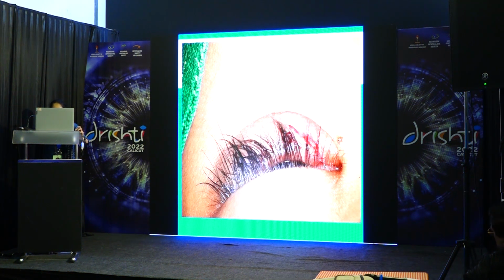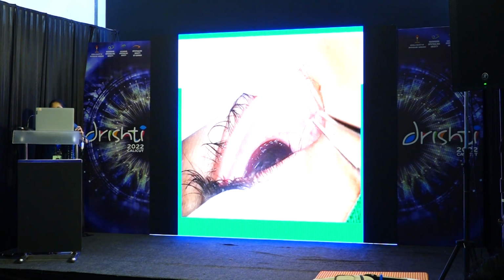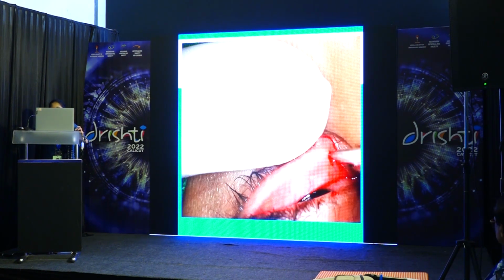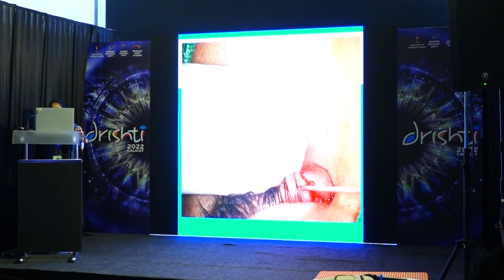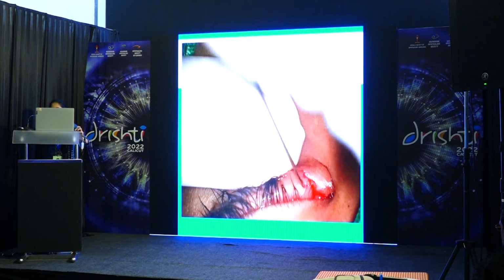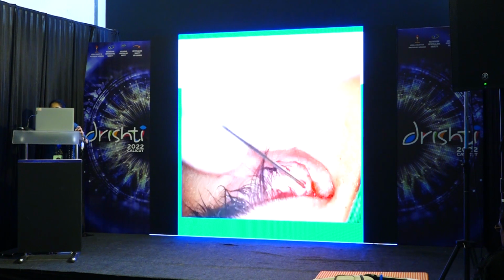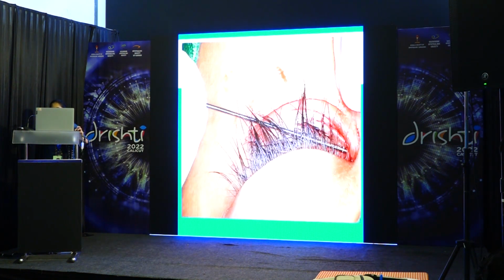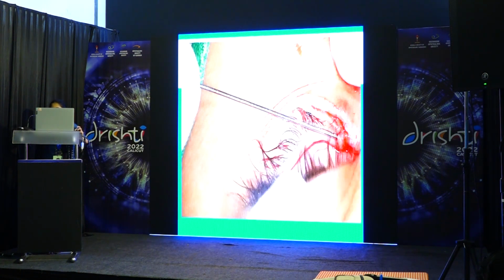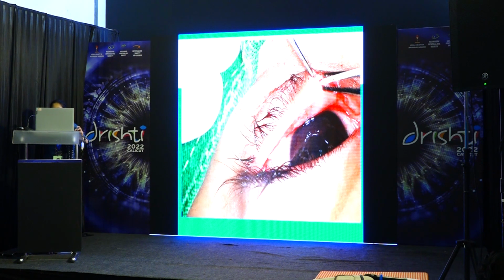So I'm going to be showing a video where I'm using a monocanalicular stent. The essential steps here would be identifying the cut edge of the canaliculus. So first I'm doing a punctal dilatation. This is a 4-year-old child with a canalicular tear. I'm using a lacrimal probe. So usually the cut end of the canaliculus can be identified as a whitish tubular structure surrounded by the pinkish orbicularis tissue. So what is essential is that, let me pause this video.